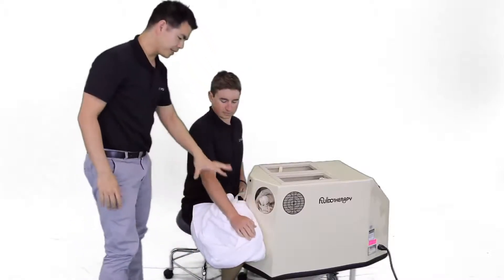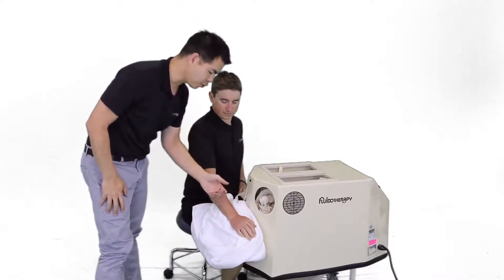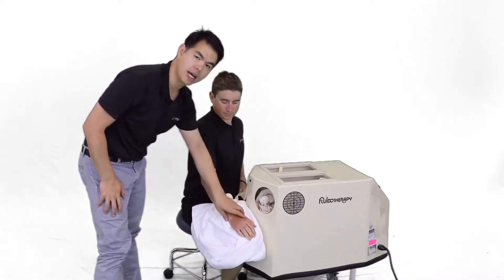Always reassess the patient's tissue. It is normal for it to be slightly red and warm to the touch.